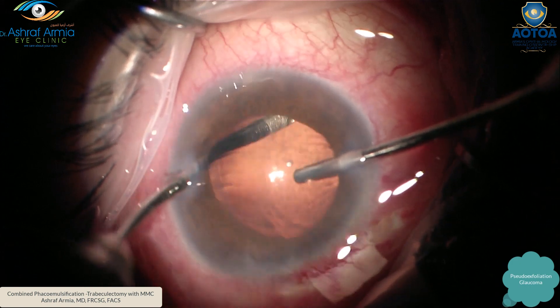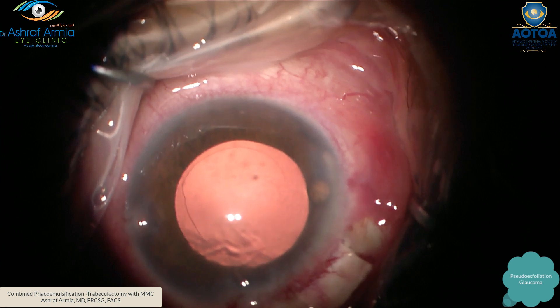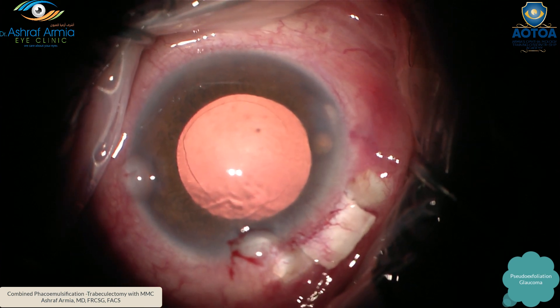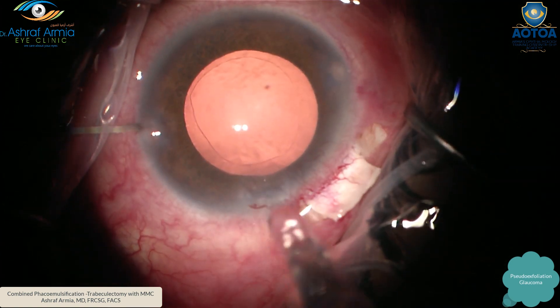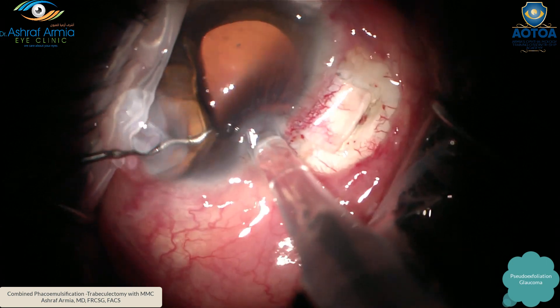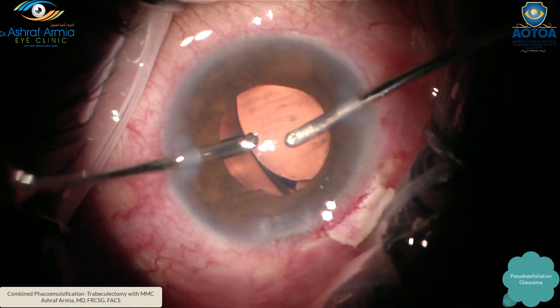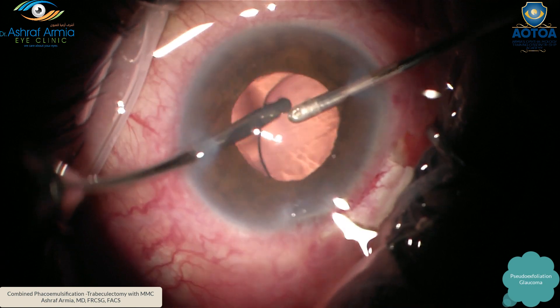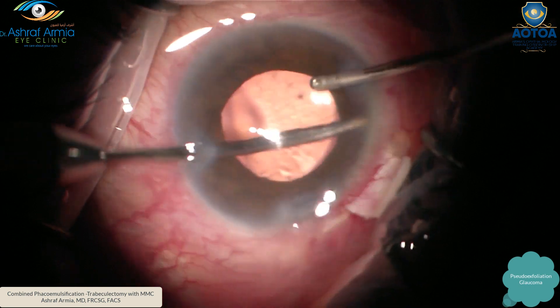Inject cohesive viscoelastic into the bag, then implant a single-piece hydrophobic IOL — I prefer hydrophobic rather than hydrophilic in these cases. It is very important to remove the viscoelastic from under the IOL and from all over the anterior chamber and in the bag.